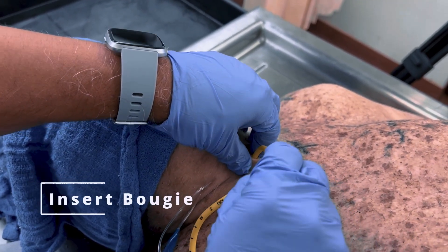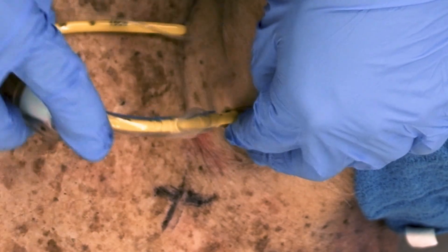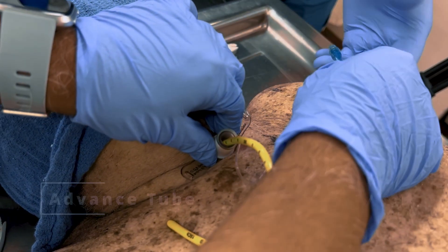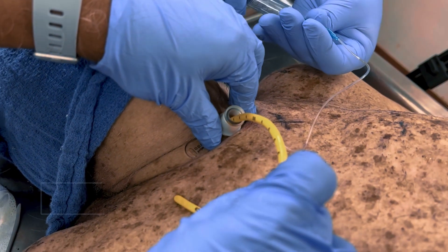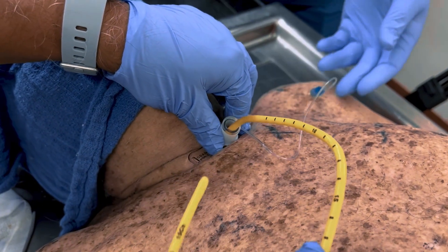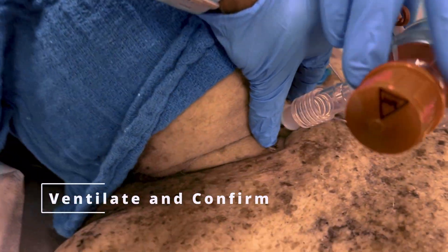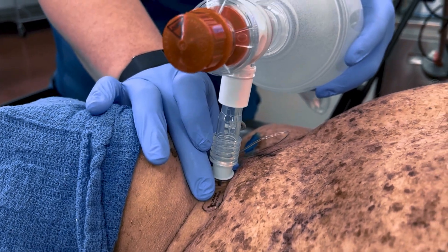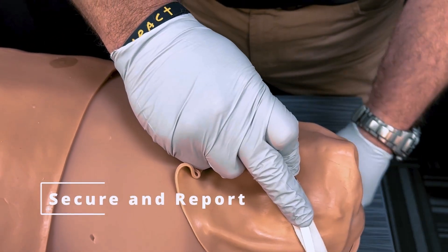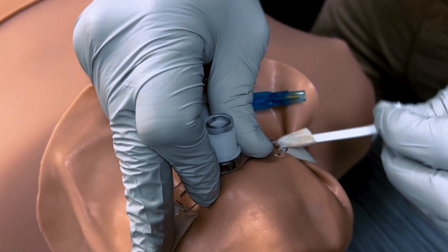Insert the endotracheal introducer bougie caudally into the membrane through the incision. Slide the tracheal device over the bougie caudally immediately through the incision. Inflate the cuff and then remove the bougie and syringe. Ventilate the patient and confirm placement through ease of ventilation, auscultation, observation of chest wall movement, and appropriate end tidal CO2 waveform. Secure the airway using the tube holder strap, apply dressing to the site if there's bleeding, and contact the medical consult line to advise of the result.